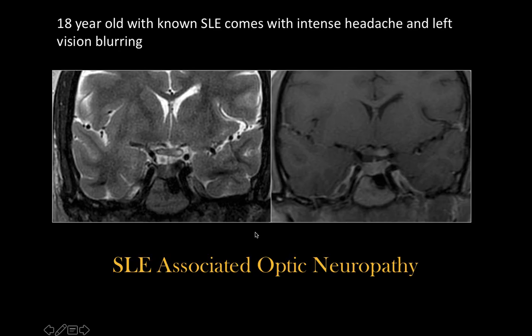This is an 18-year-old boy with known SLE who presented with intense headache and blurring of the left vision. We see abnormal signal involving the optic chiasm on both sides, with the left side swollen and showing enhancement. This is SLE-associated optic neuropathy.